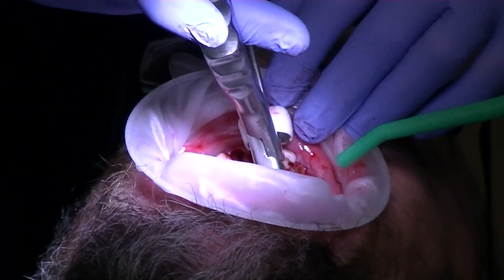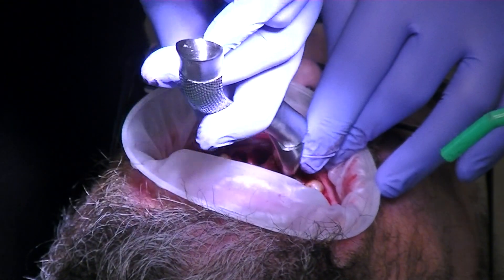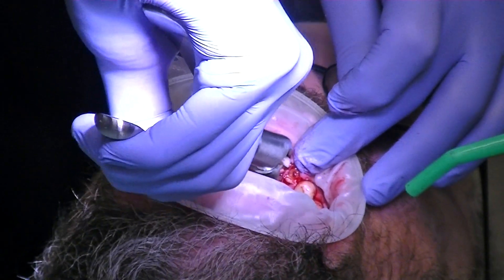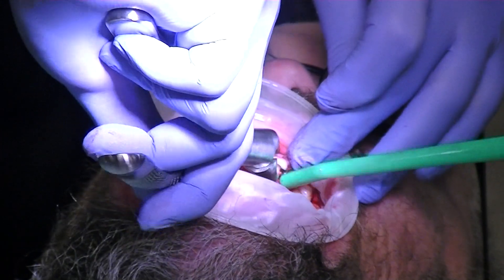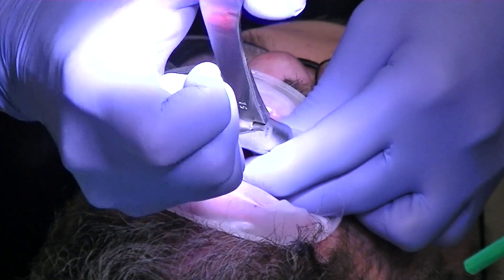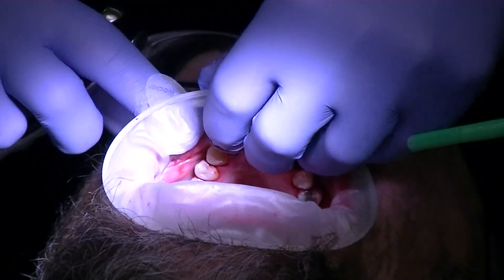Now we go back to our forceps. I want to make sure I grab it on solid tooth structure so I don't just break the coronal portion. Here we go — just do a twist. There's a lot of mush in that tooth. It's not as loose, so we're going to go back to the physics forcep.